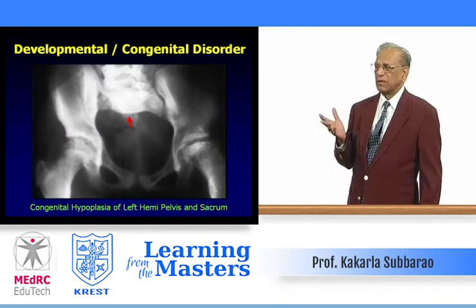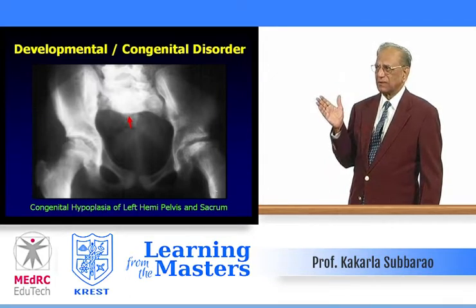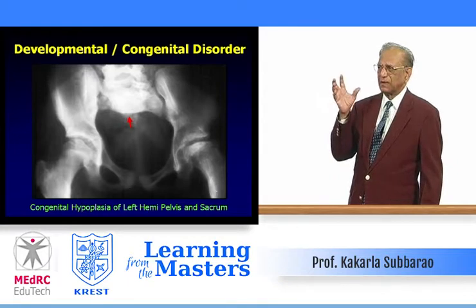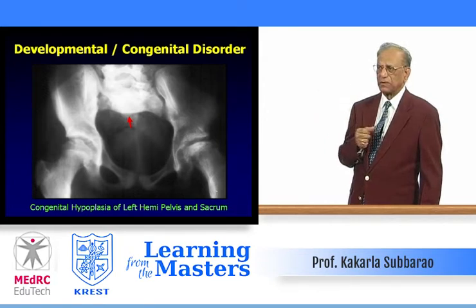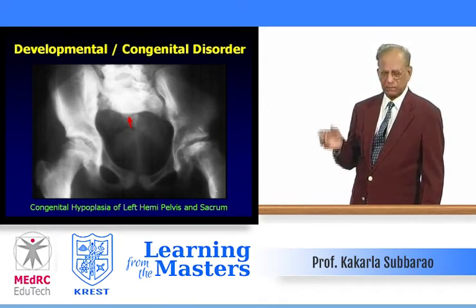Congenital hypoplasia of the left hemipelvis — look at the asymmetry between the right and the left. This is atrophy of the hip bones, the innominate bones, and partial absence of the sacral bones. This is all congenital developmental disorder.